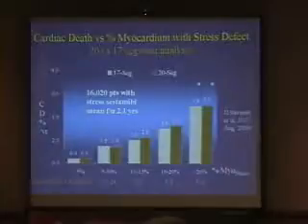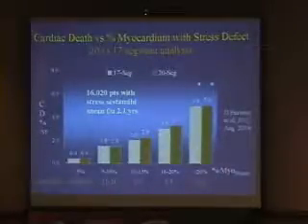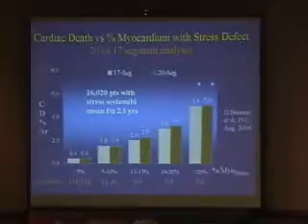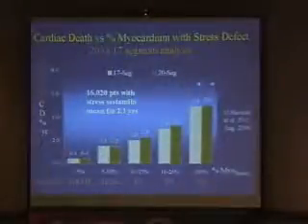It doesn't really matter whether we're talking about 17 segments or 20 segments or 14 segments or 12 segment analyses, and all of these are common analyses for the nuclear data, because if you normalize for the maximal score, you can end up comparing the different approaches.